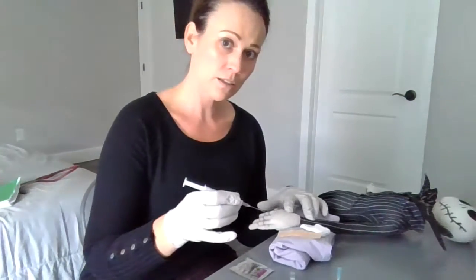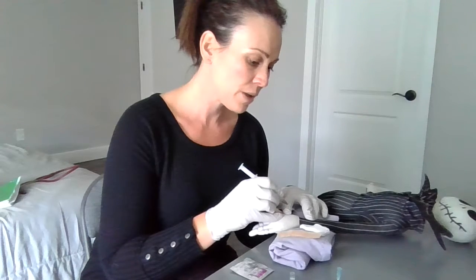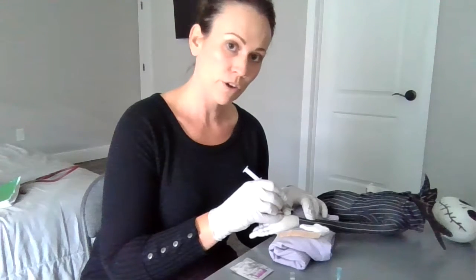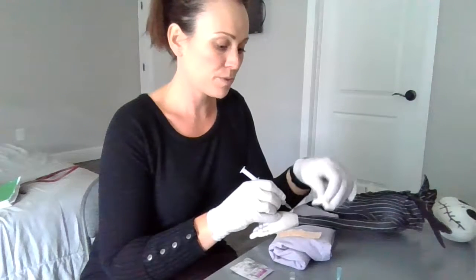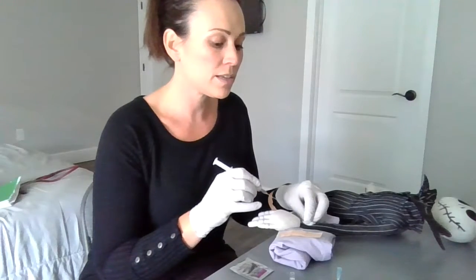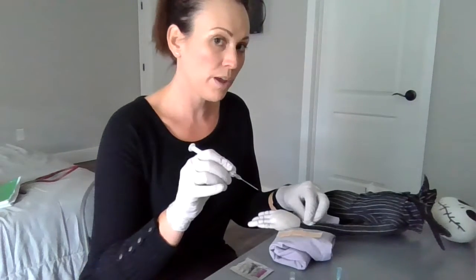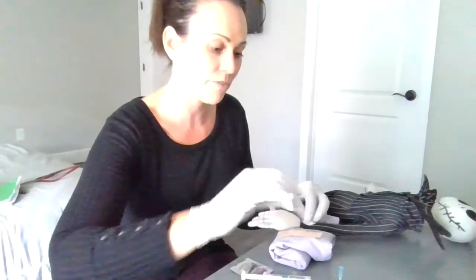Okay, Mr. Skellington, on the count of 3, I'm going to insert the needle. 1, 2, and 3. Insert at a 45-degree angle. Make sure that the blood fills up. I already have everything prepped and ready. So I'm going to put some pressure down and take my needle out. Keep the needle away from me, and I'm going to cork the needle. I'm going to hold down pressure on this artery for 3 to 5 minutes.